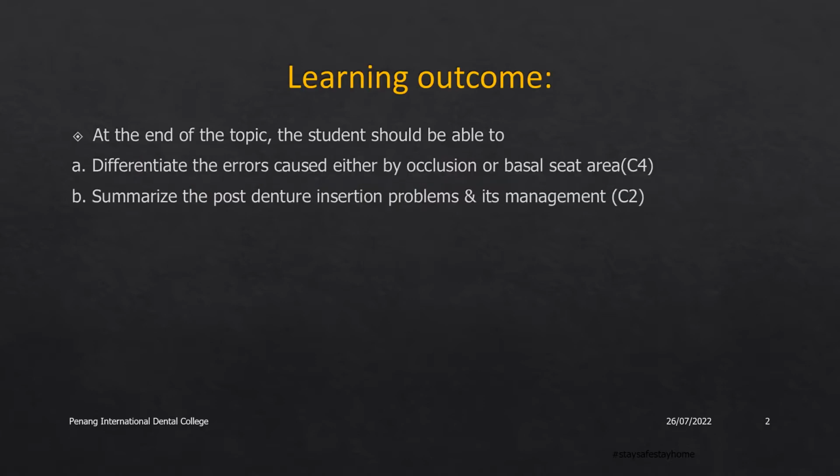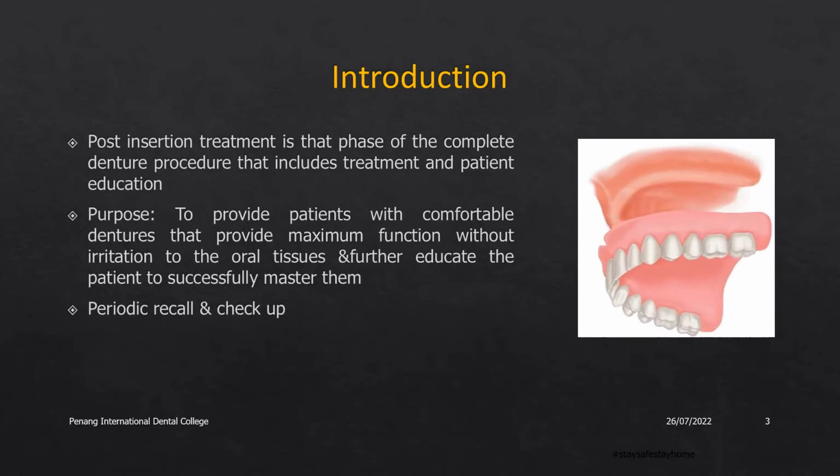So the learning objectives are: you should be able to differentiate the errors caused by the occlusion and the errors in the denture basal seat area. You should also be able to summarize the various post-denture insertion problems that happen and how to manage them. So basically, post-insertion treatment is a phase of the complete denture procedure that includes the treatment and patient education.